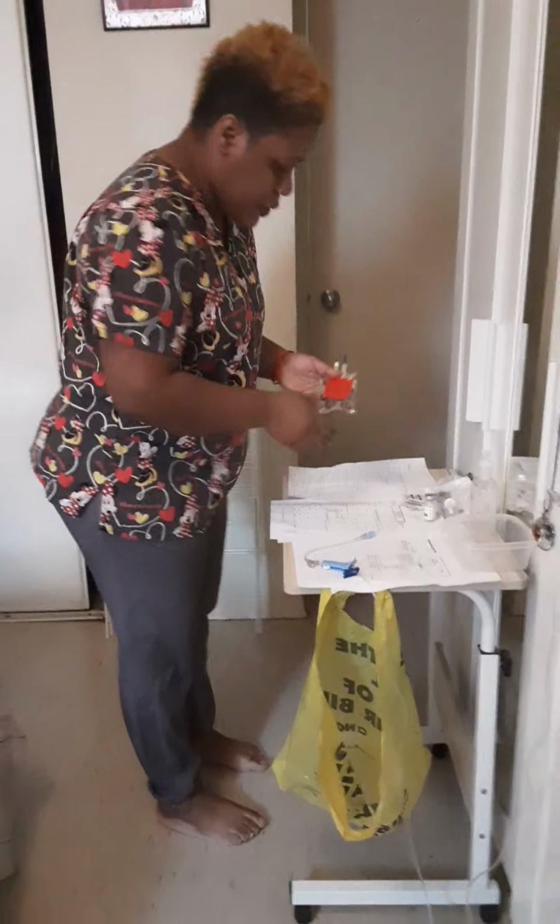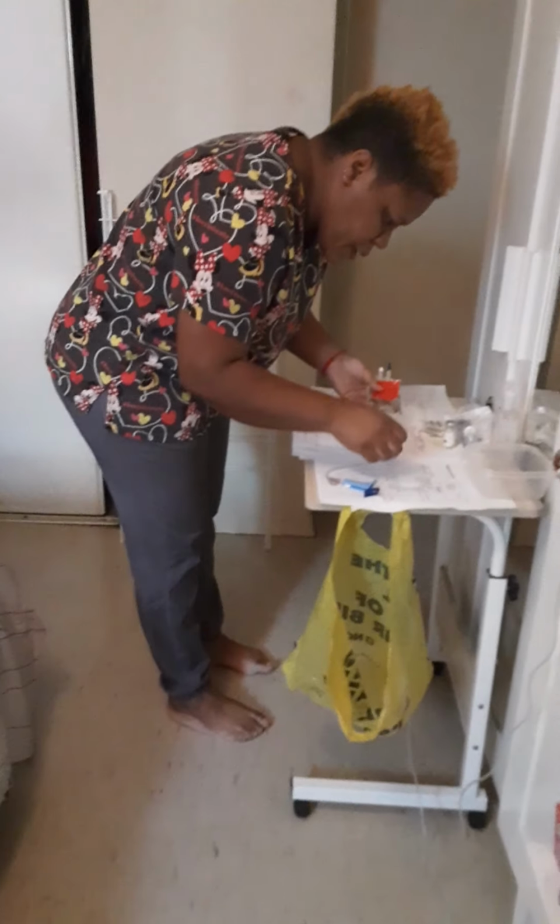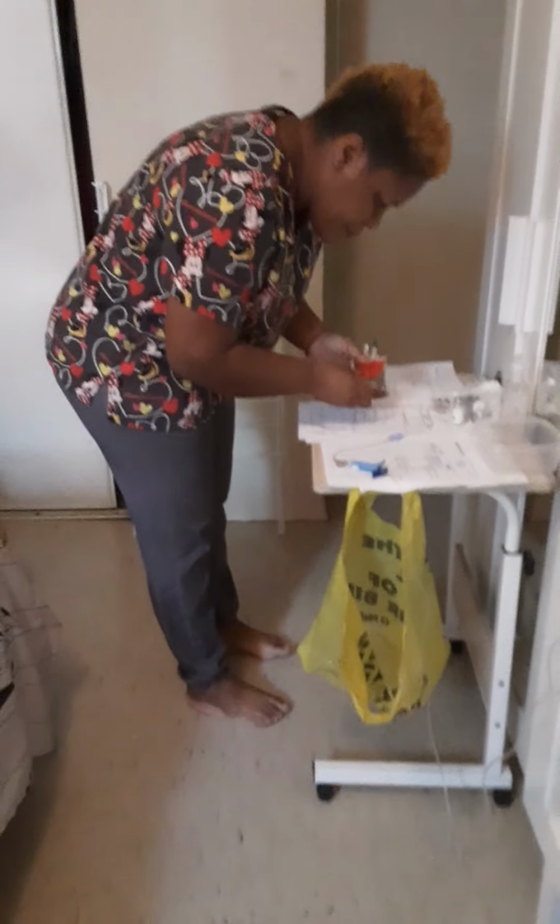After that is done, I am going to put the label that I have already prepared on my bag. Then I'm going to check for the third time what I have prepared with my MAR and my doctor's order. The patient's name, Mr. PNL. The medication is pantoprazole 40 milligrams, via IV every 6 hours. His date of birth, and all other information would be on there.